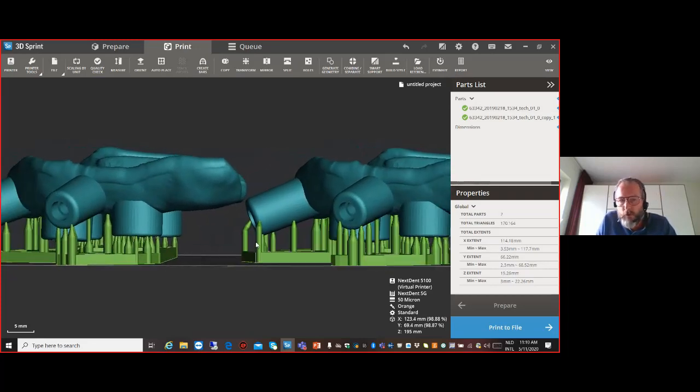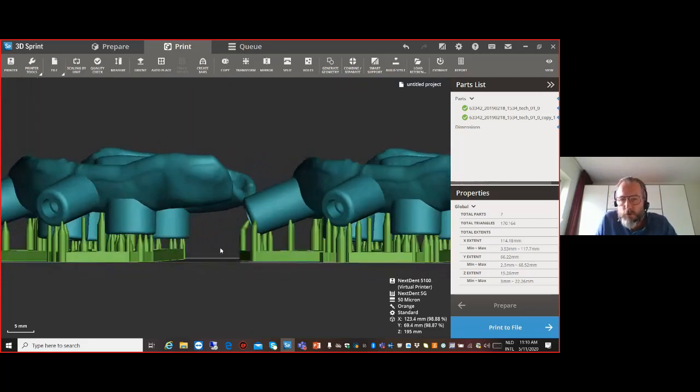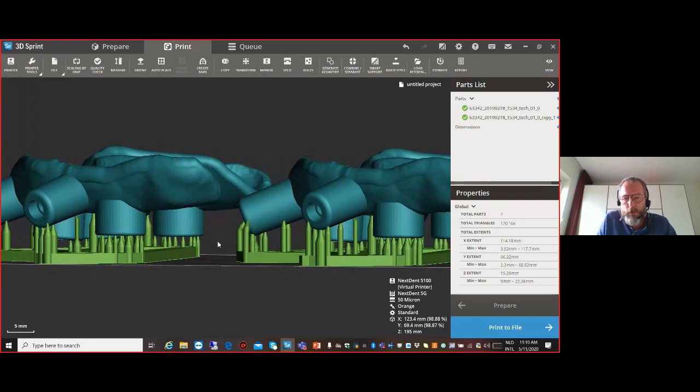Now, what does this mean in practice? And that's why we are going now live to Lars, who will demonstrate and will show you what actually is the difference between the two support styles in practice. So Lars, it's up to you now.